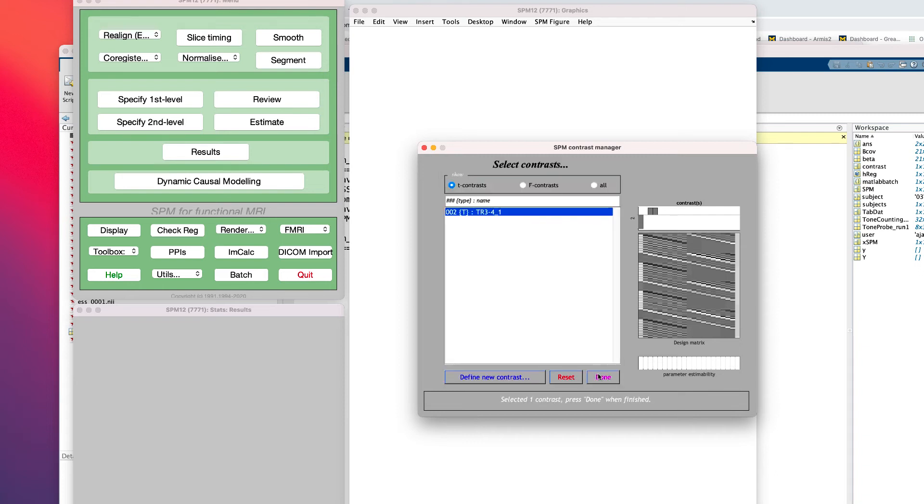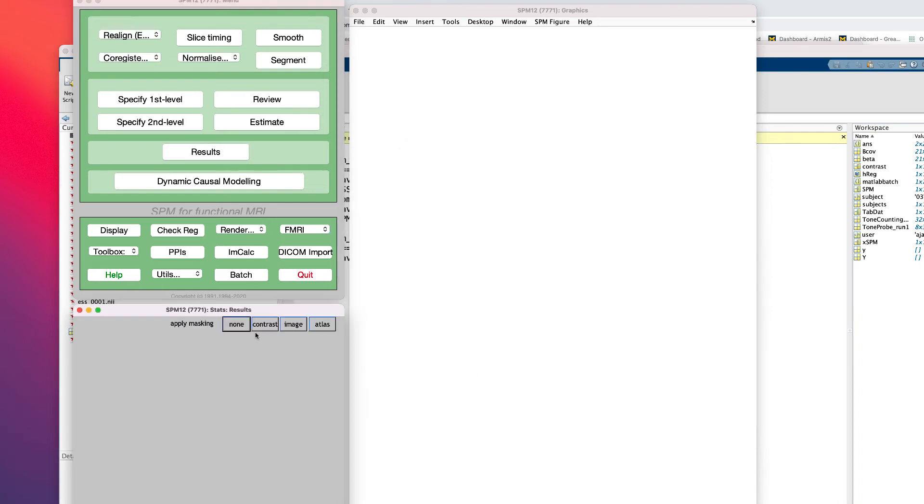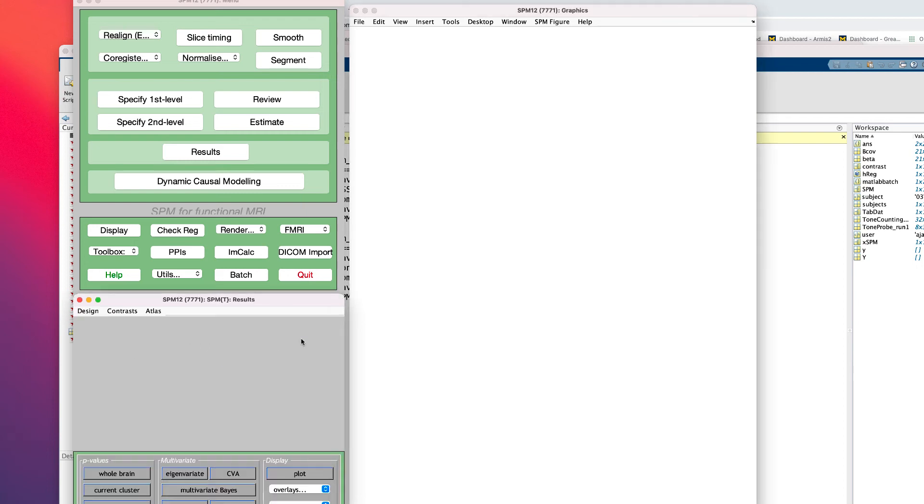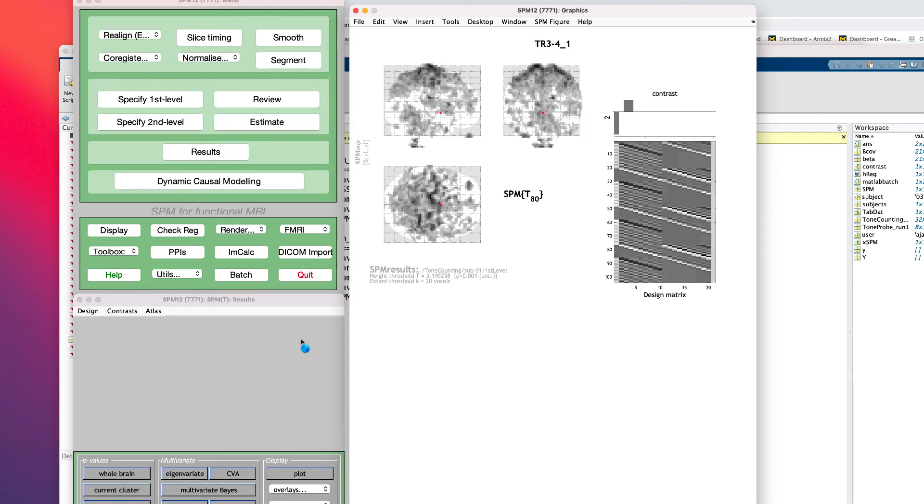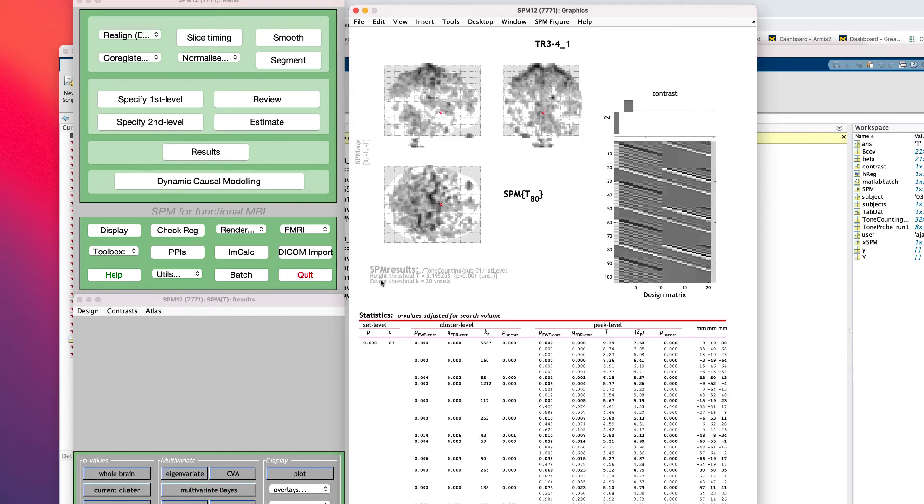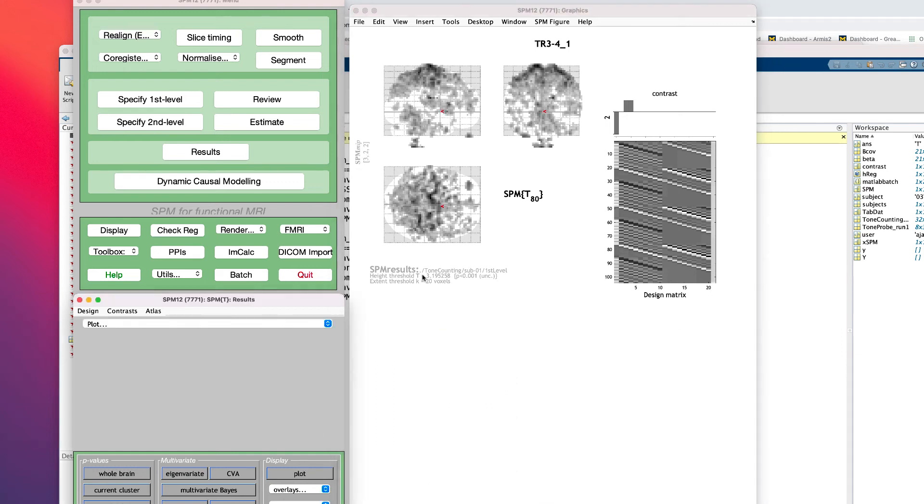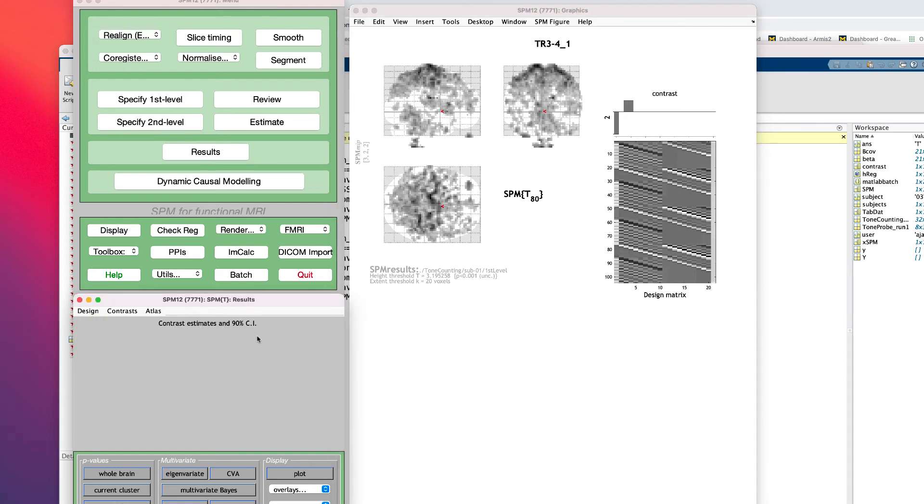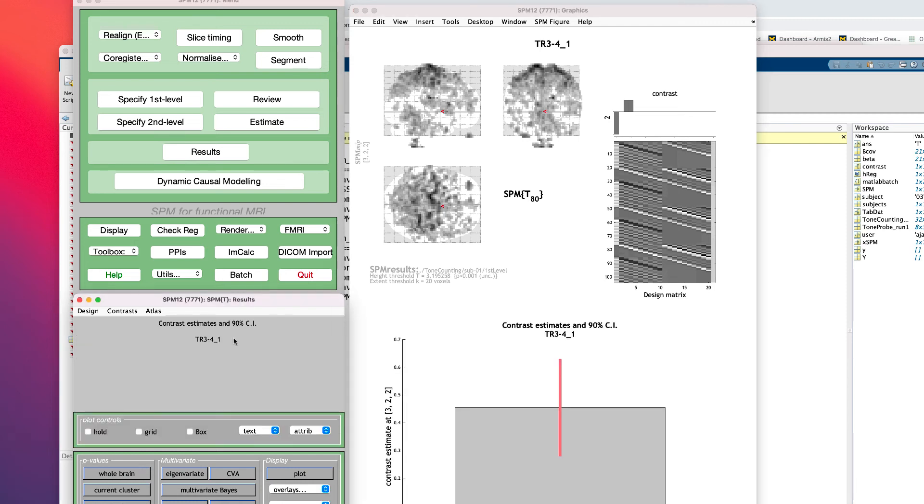Now click OK, Done, and use the same correction settings as for the F-test. The resulting map will show where the average of TRs 3 and 4 are greater than TR-1. In this results window, you could also click the Plot button and plot the confidence interval for the contrast of TRs 3 and 4 compared to 1.